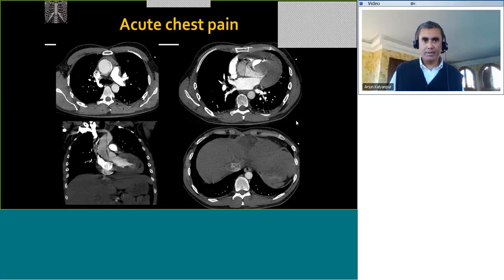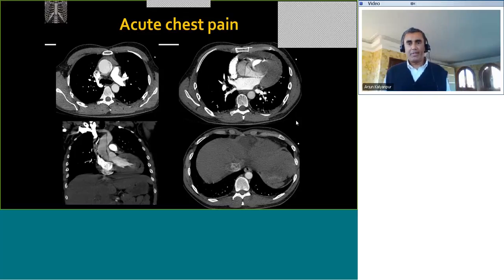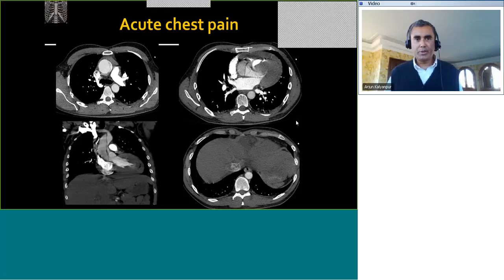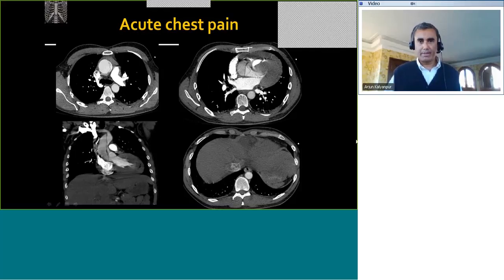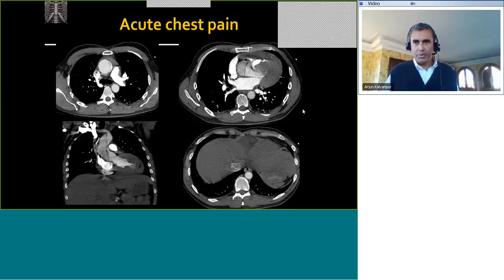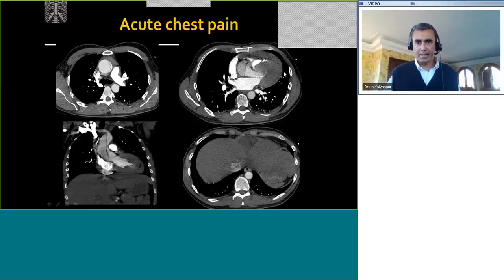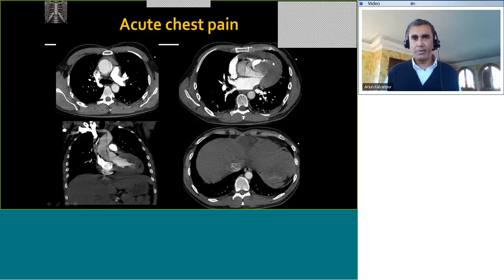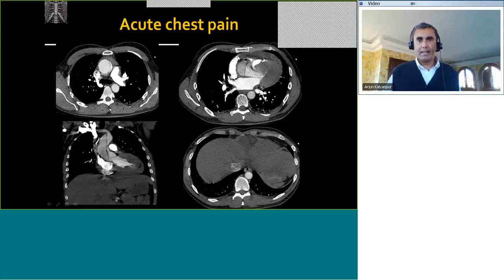Two responses from Dr. Tran and Dr. Sanjeev both said aortic dissection, which is absolutely correct. Having identified the dissection, there are a couple of other things we need to look for in these patients. Look at the image on the top right — there is an additional finding: when looking at the heart, always check the myocardium and pericardium. In this case the pericardial space is distended. There is a hyperdense pericardial effusion, which in a patient with aortic dissection is extremely worrisome for a leak of the dissection into the pericardial space — hemopericardium.